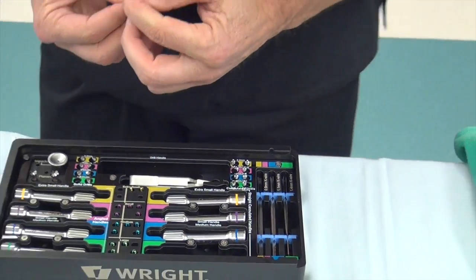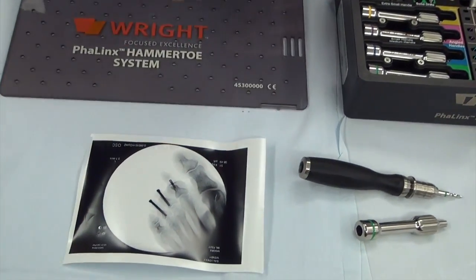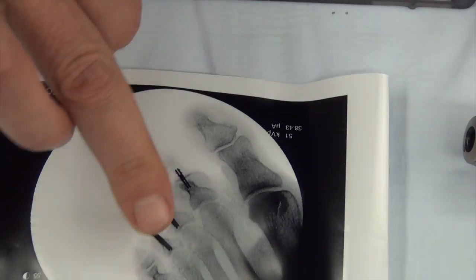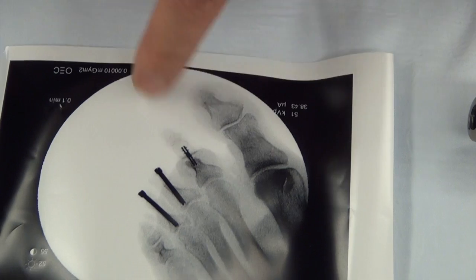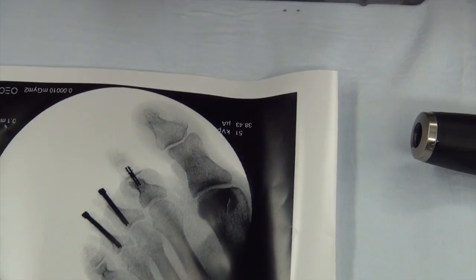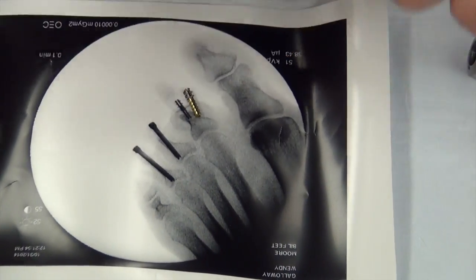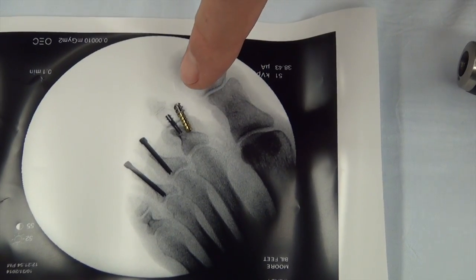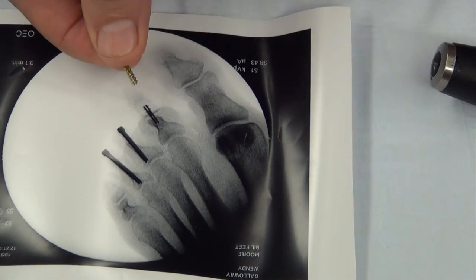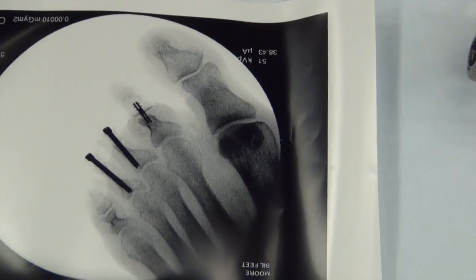Probably the easiest way to show you — on this picture here, the case we just did, there's some old hardware in there. This right here is a small one. These two screws are from an old procedure; I've had to fix this lady's second toe which was never fixated the first time. And believe it or not, that internal object right there is this small one right here. You can see that this part we screwed into the middle bone, and then this part here we just popped into the proximal phalanx, and then it keeps the toe straight in line.